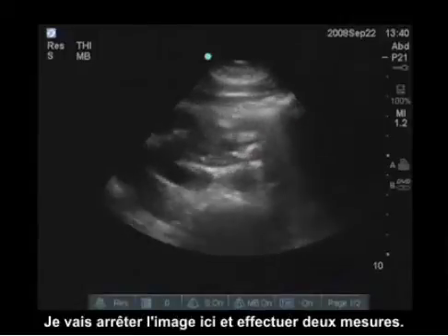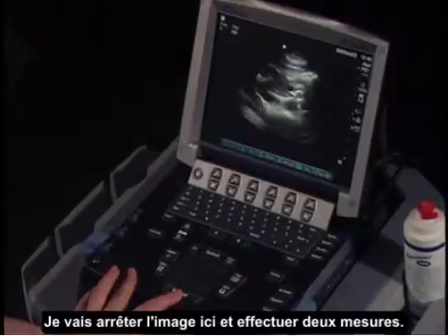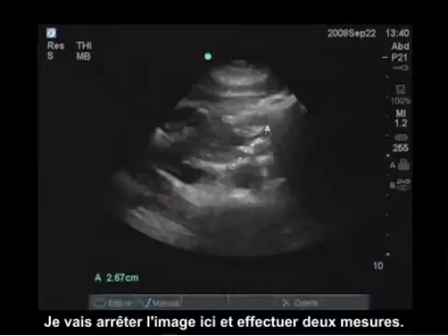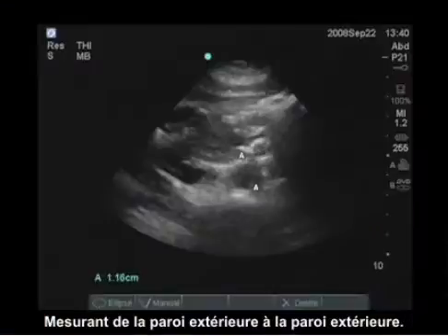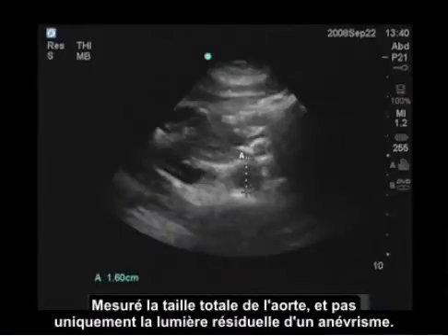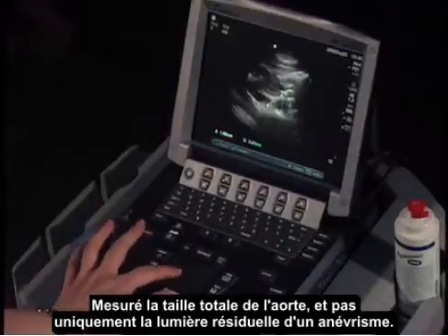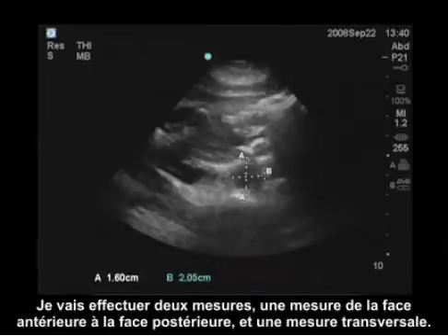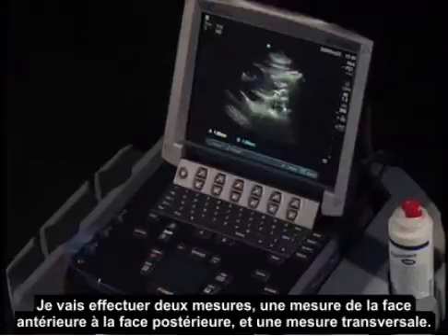I'm going to freeze the image here and perform two measurements, measuring from the outside wall to outside wall so I measure the entire size of the aorta and not just the residual lumen of an aneurysm. I will perform two measurements: anterior to posterior, and a transverse measurement.